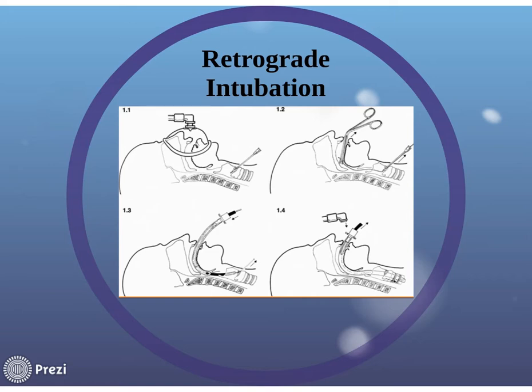Then what you're going to do is, they don't show it, but here I'm going to get some hemostats. I'm going to secure it, right? It really would be a bummer to lose it that soon into the adventure. Then we're going to take this off, and we're going to put the McGill's there.